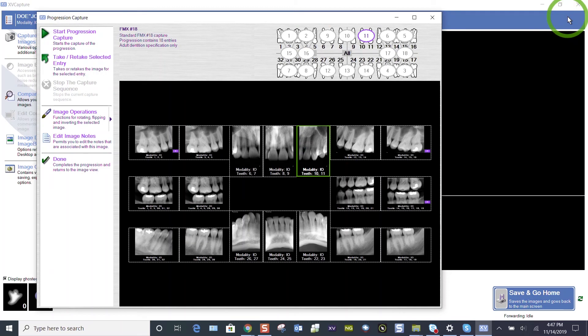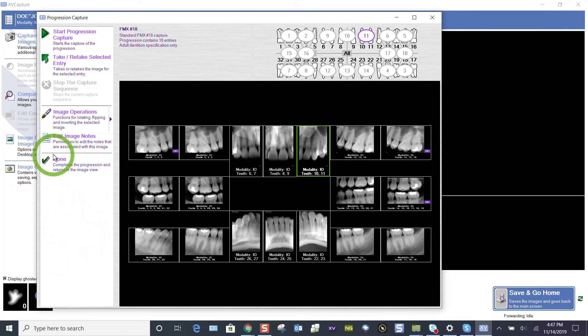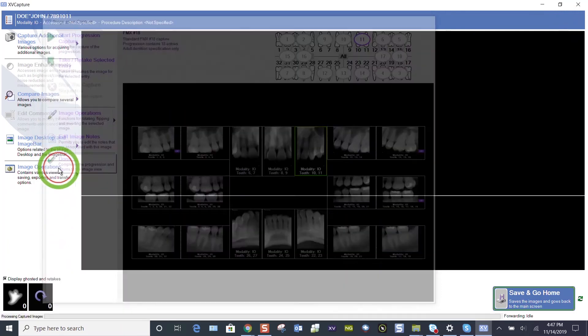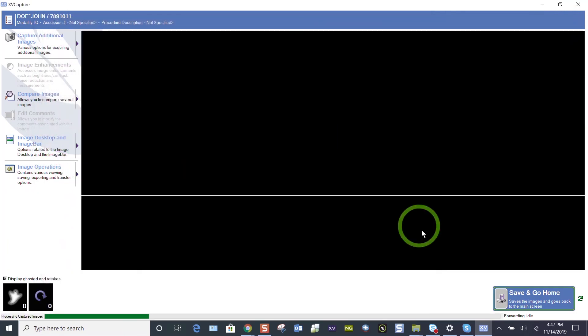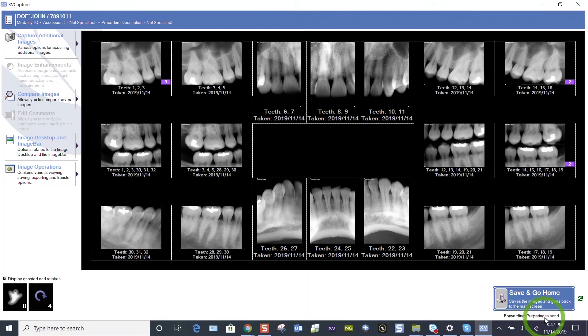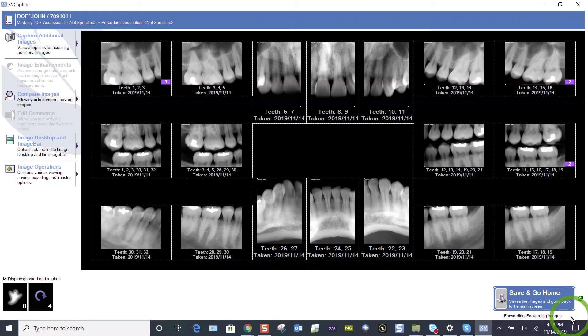But when you are done taking your images, you've taken all of your retakes as you went, you've assessed your layout at the end and decided to retake those that you needed to. When you're done, please press the done button, the green check mark done. And at that time, just pay attention to the status change in the lower right hand corner. It's preparing to send, preparing to send. I've got quite a few images here, 21 images. It might take another 10 or 15 seconds, but it doesn't hinder you in your process.